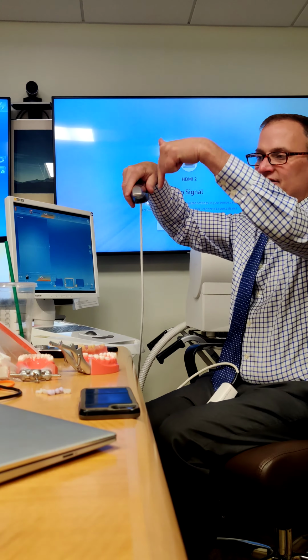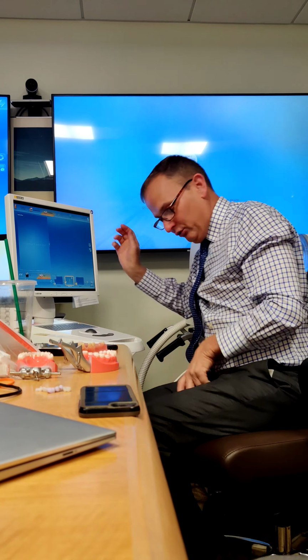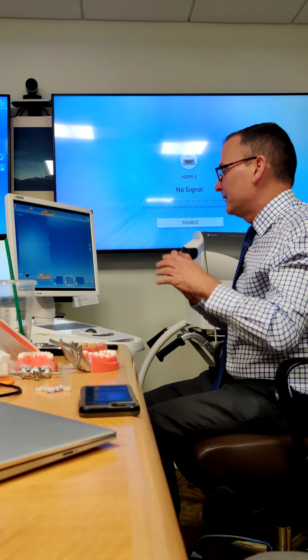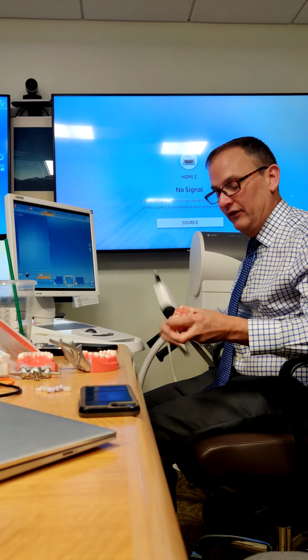Right? Do you see that? It's scanning straight down, not at an angle. That's just, you know, they both work perfectly well. So it always takes you onto your treatment arch. So we're on the upper.